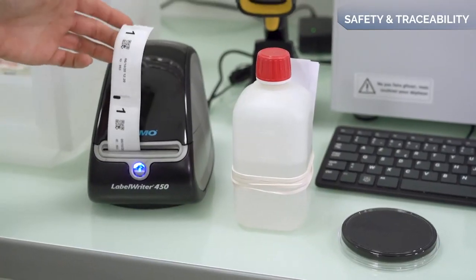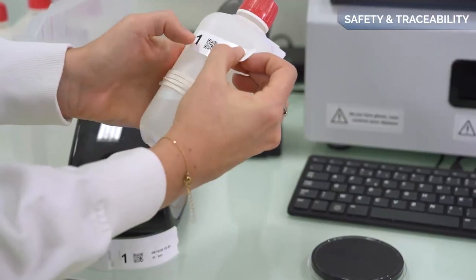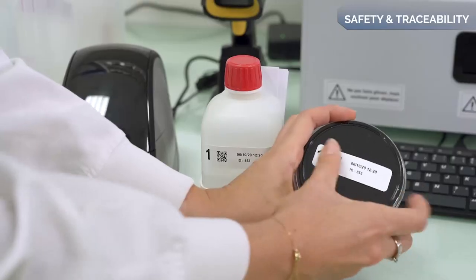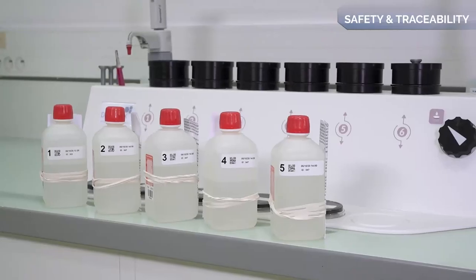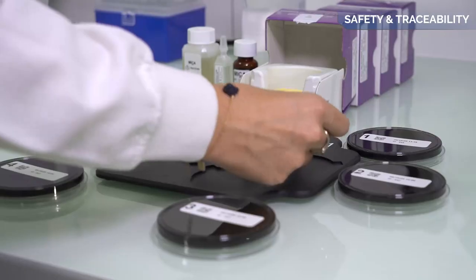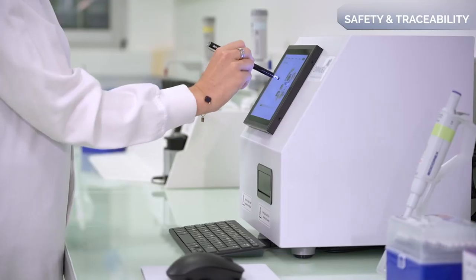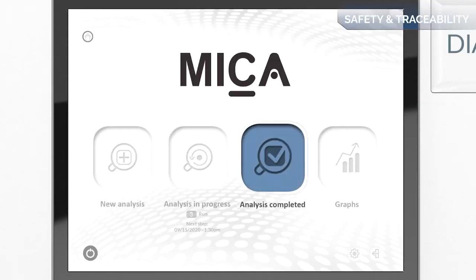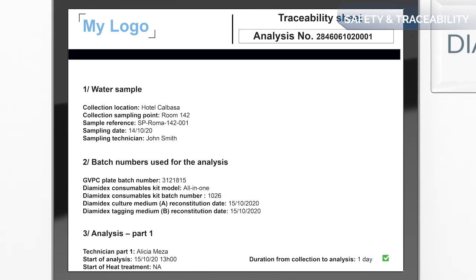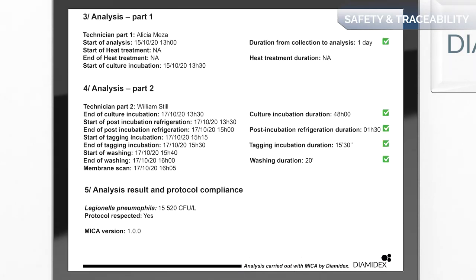The MICA solution makes it possible to trace samples from the sampling bottle up to the analysis report by means of linking QR codes and numbers present on each item of equipment used. For each analysis, all of this information can be accessed in the form of traceability reports and can be exported for integration into your usual quality management system.